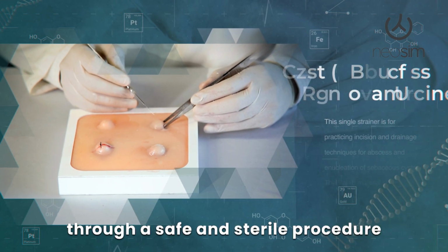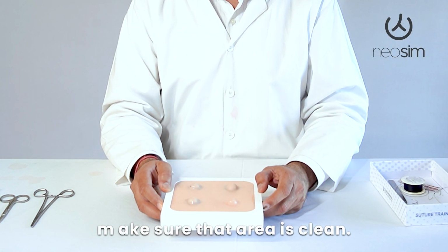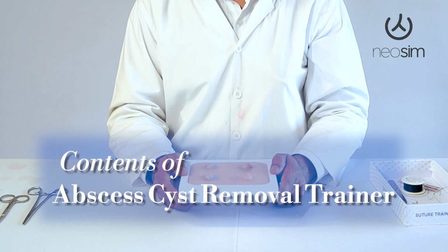Hi everyone, today we are going to walk you through a safe and sterile procedure for removing an abscess and a cyst. Before the procedure, make sure that the area is clean. Sterilization is the key to prevent any further infection.